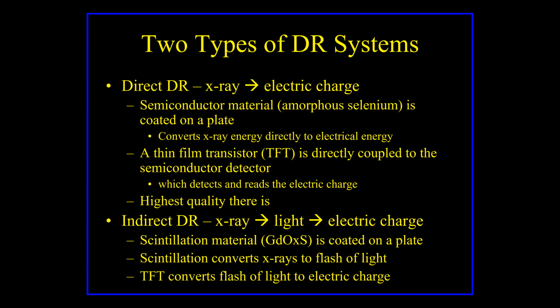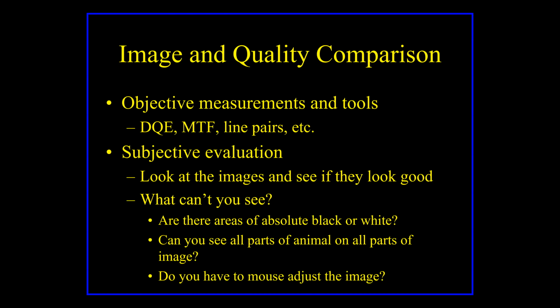There's other ways that if you shop around for digital x-ray systems and flat panel detectors, some of the salesmen will learn key jargon and try to confuse you with it and make you think that they're smart, which usually they're not. So they'll say, well, yeah, my system has a higher DQE and the modulation transfer function is better than Joe Blow's system.